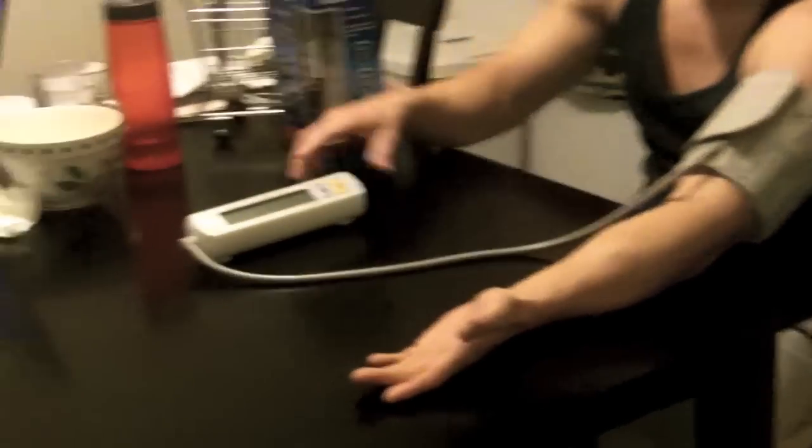Once you do that, put your arm out. On this device you have the systolic and the diastolic readings. You basically want to be between 110 and 120 on the systolic and about 70 to 80 on the diastolic. Press 'on' and it will automatically go. I recently just ate, so I'm not going to press it right now.